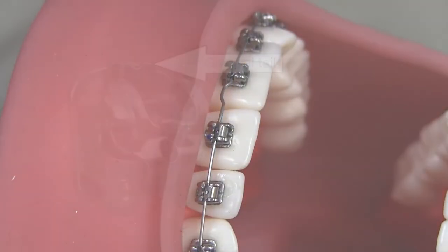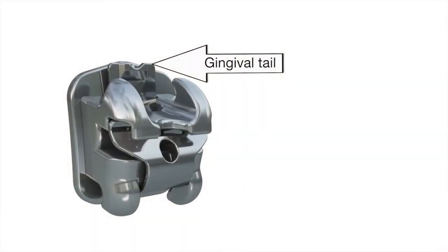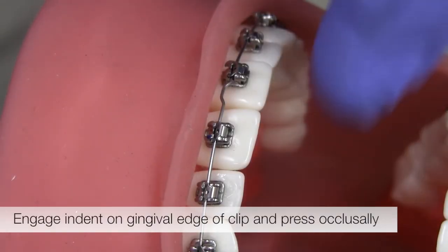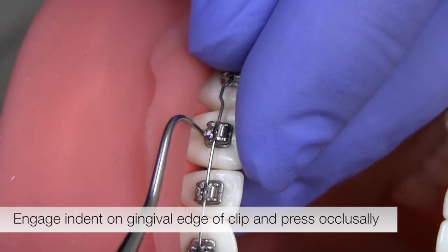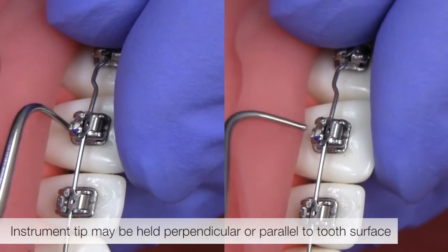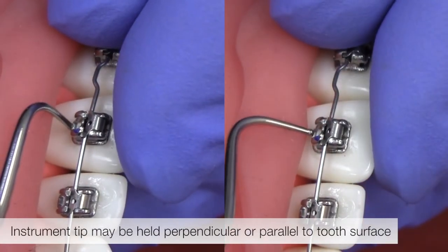Empower metal brackets may also be opened via the gingival tail of the clip. Using the single prong tip of the instrument, engage the indent on the gingival edge of the clip and press occlusally. Depending on access and user preference, hold the instrument either perpendicular or parallel to the tooth's surface.